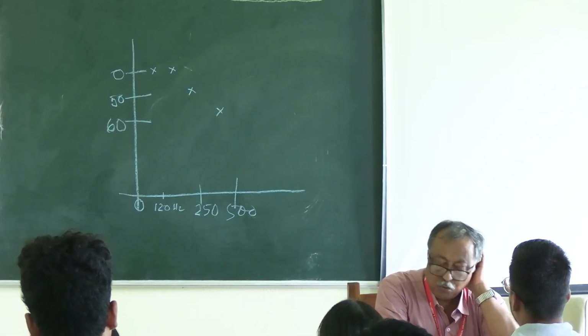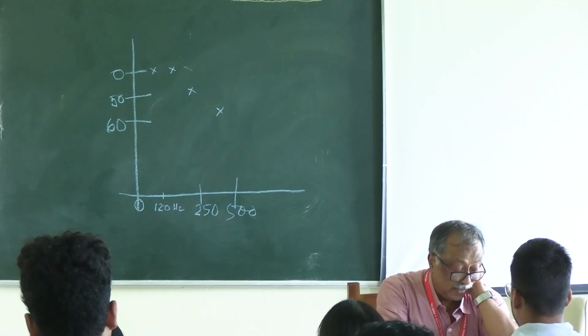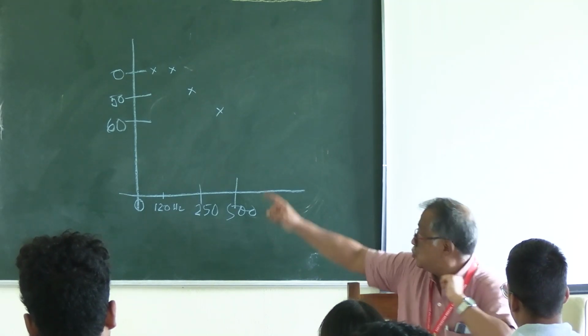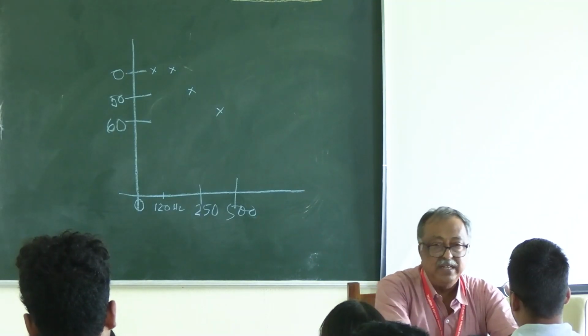Sound pressure level produced by the audiometric machine in reference to audiometric 0. Already I have described it. Suppose the 70 decibel reference audiometric 0, I have shown you the 60, the 70 decibel. That means the 70 decibel hearing level, 70 dBHL.